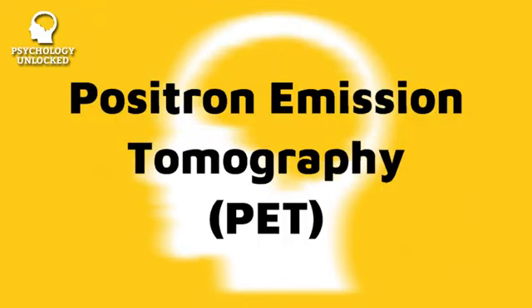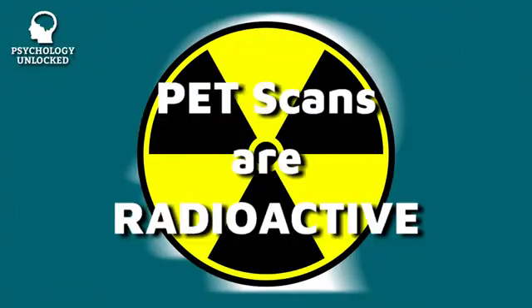And to balance the structural functional table, let's look at one other example of a functional brain scan. And this one, unlike all of the other scans we've discussed in this video, is an invasive technique. The scan is called Positron Emission Tomography. It's that Greek cutting word again. PET scans are used less often than fMRI scans nowadays, as it can't be used on children or premenopausal women because it's radioactive. It's radioactive? It's what? So, you know I said positron emission tomography scans are invasive.